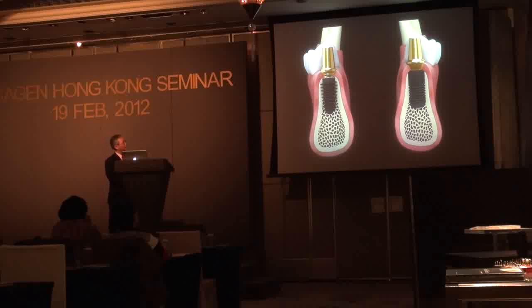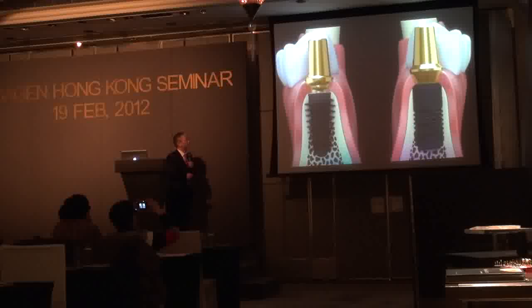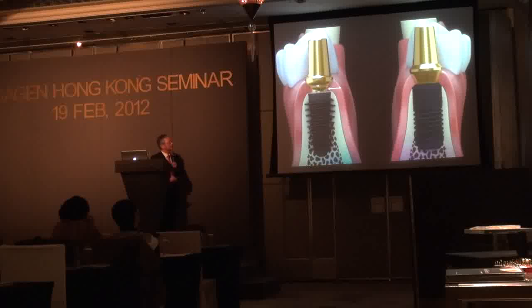So, like this, same ridge size, same diameter implants with their abutments. As you see, at least you can make 1 millimeter thick gingiva. 1 millimeter thick gingiva is very important, as you see in the Nozawa article.